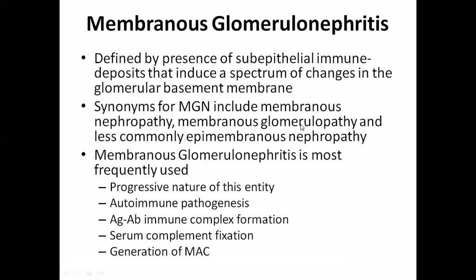So I need not discuss the basic stuff. We shall start with the histopathology of membranous glomerulonephritis, as we are already aware of how you have to make a diagnosis of membranous. There are a few newer markers which I am going to discuss, and if you have attended my class, there are some things which will be a repetition. So before I start, okay.